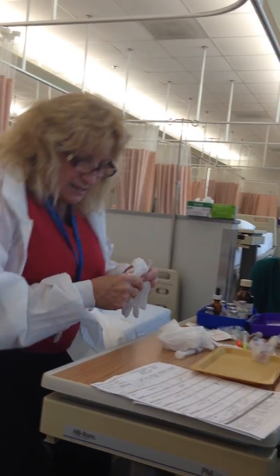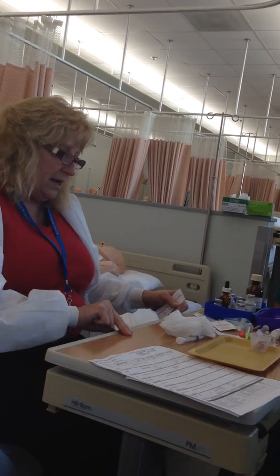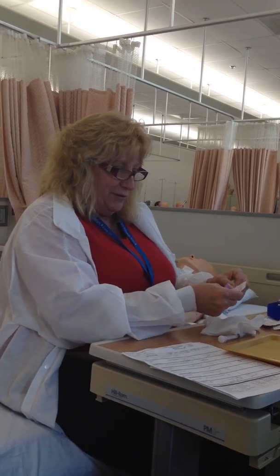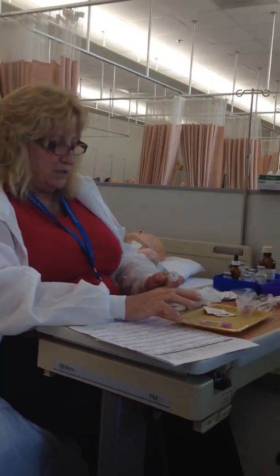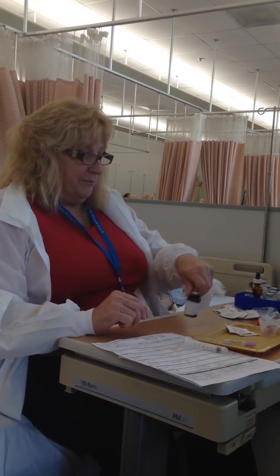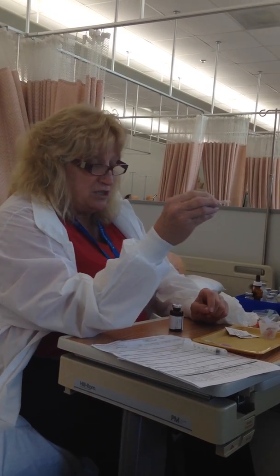So you're going to have the things that you need to do the draw and to give the med. You don't need 1,000 of these, you only need a few, okay? And you have 2 needles, one to draw the medication and one to change before you give it to the patient. Are they the same though? Yeah. It should be a 1.5-inch needle.